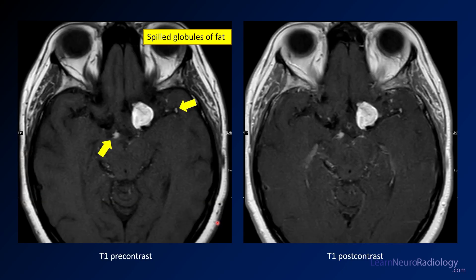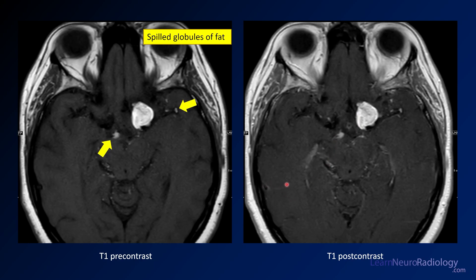It's potentially possible that the patient in this case was having headaches from a chemical meningitis from the fat rupture. Here you see your pre- and post-contrast T1. You have some little spilled globules of fat in the left sylvian fissure, as well as anterior to the midbrain and in the interpeduncular cistern. When you give contrast, you're not really seeing a lot of enhancement — most of the hyperintensity is coming from the intrinsic signal of this lesion. So we have this T1 hyperintense lesion in the suprasellar region adjacent to the carotid.